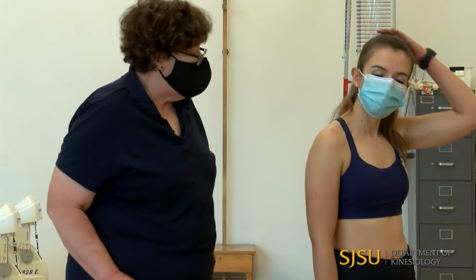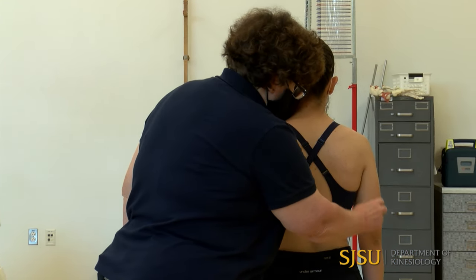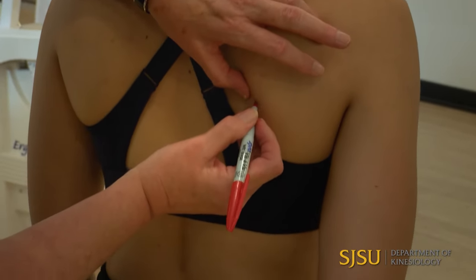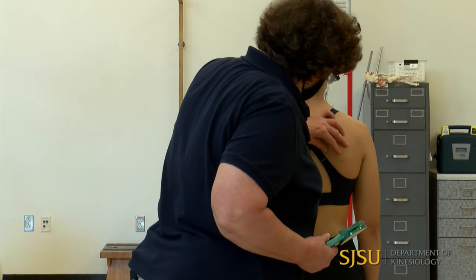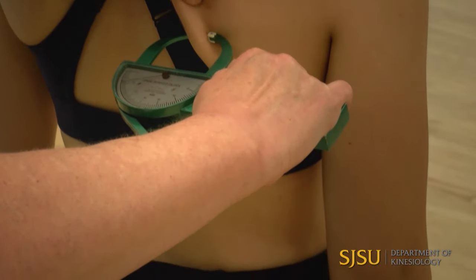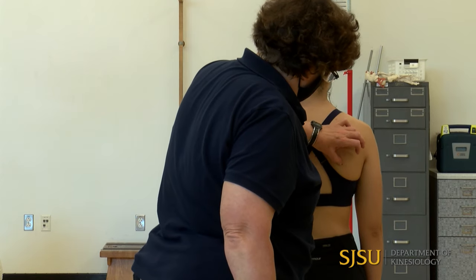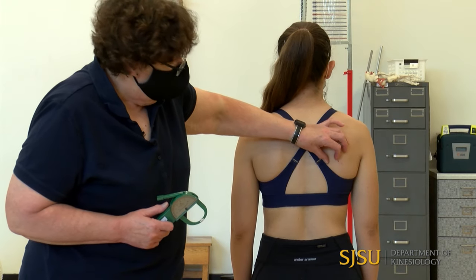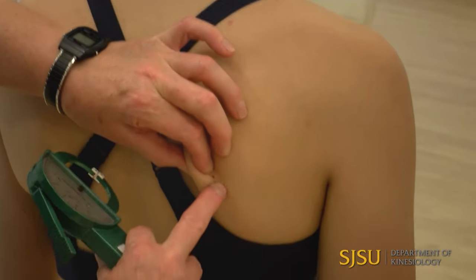For the subscapular, it's right at the inferior angle of the scapula. If it's hard to locate, she can bring her arm back to wing the scapula out. I put a mark right at the inferior angle — it's a diagonal skinfold. I pinch above and place caliper tips right where my mark is. The standardized site says just below the inferior angle; Jackson says one to two centimeters below — they are essentially the same spot. I pinch right below that inferior angle.